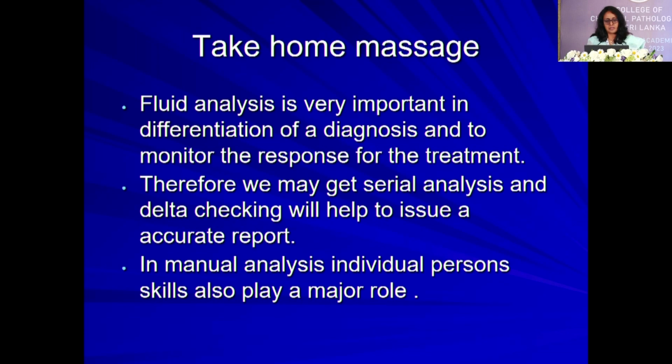The take home message I want to give you is, fluid analysis is very important in differentiation of a diagnosis and to monitor the response to treatment. Therefore, we may get serial analysis, and delta checking will help to issue an accurate report. That means if you get a serial analysis of the same test, it's better if you look for the previous value of that same test and then issue the report.